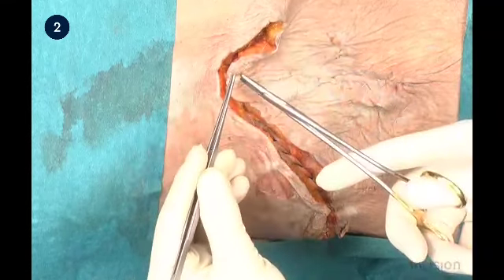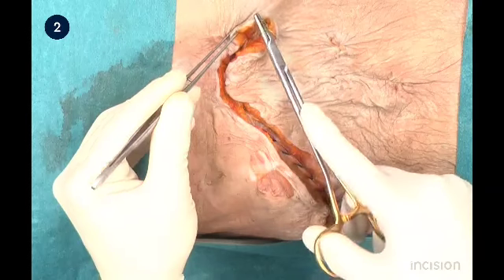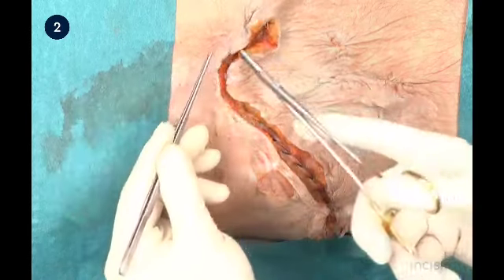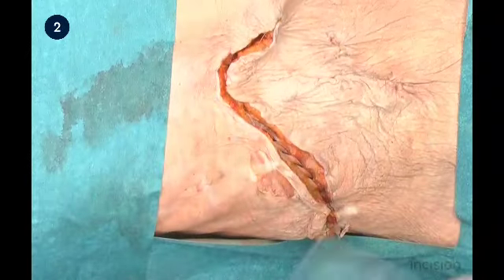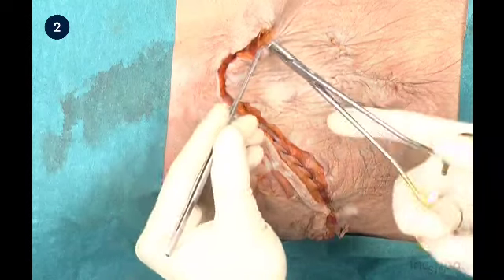The skin is closed using a continuous intracutaneous absorbable suture. In the event of peritonitis or an increased risk of wound infection, the skin may be closed with standing non-absorbable monofilament sutures or skin staples.